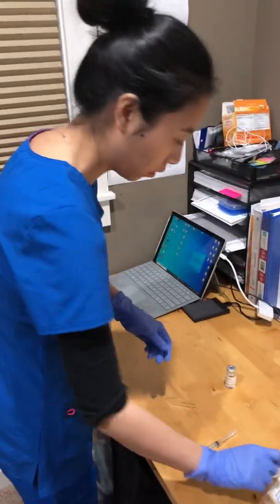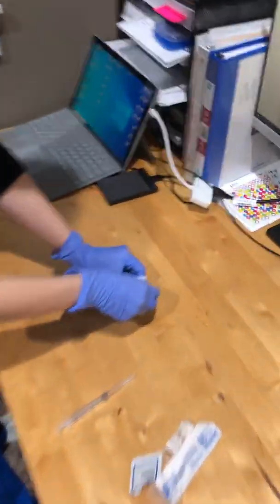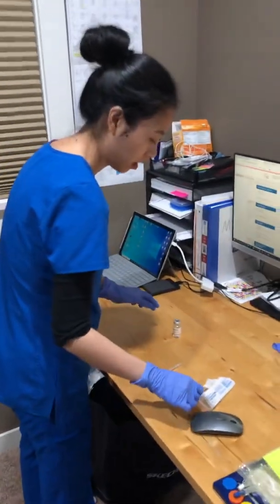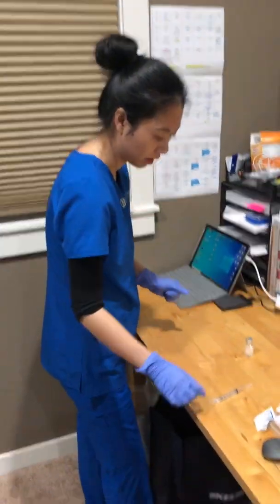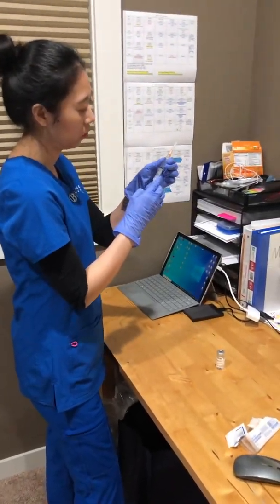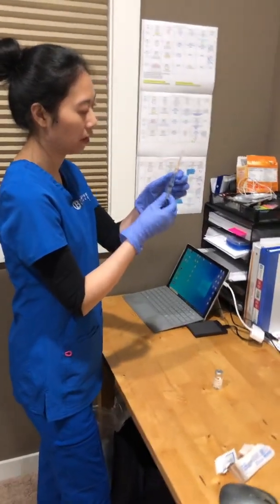Got the alcohol wipe to wipe the vial for 30 seconds and let it dry. Now it's already 30 seconds and it is dry. And I draw 2 milliliters of air.